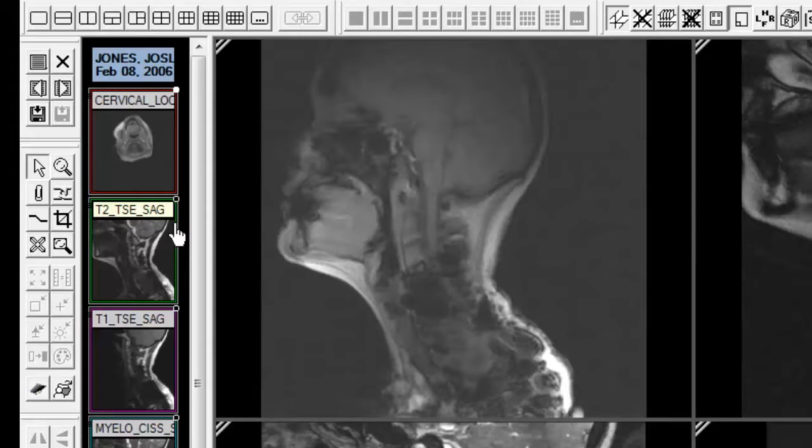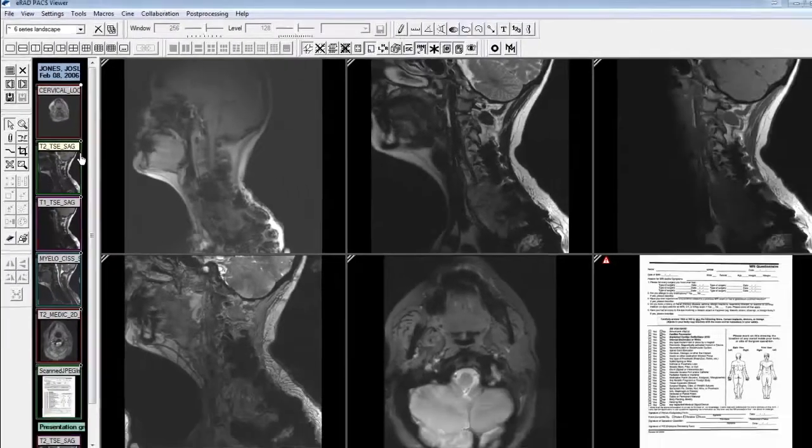By default, it is a header. However, you can change this setting to display as a footer, or even as text within the thumbnail that coincides with the DICOM overlay information.